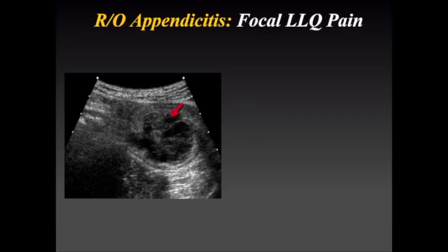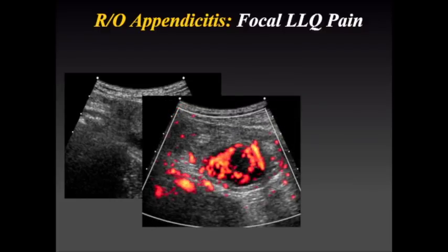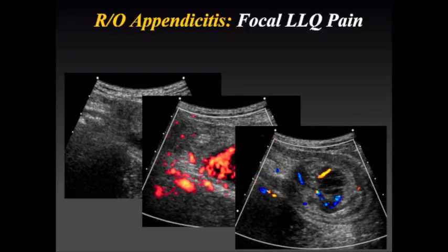Now, one of my favorite cases, and this gentleman came over to us for acute appendicitis, and the technologist immediately got me, and I went into the room, and this gentleman pointed immediately to his left mid-abdomen. Now, you're just thinking to yourself, wow, the ER docs at Stanford, they are amazing. They can diagnose acute appendicitis in a patient with situs inversus. Now, just hold on. So he points to this hypoechoic mass. It's quite vascular.